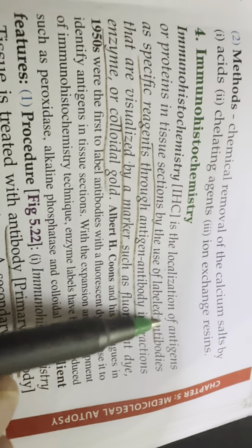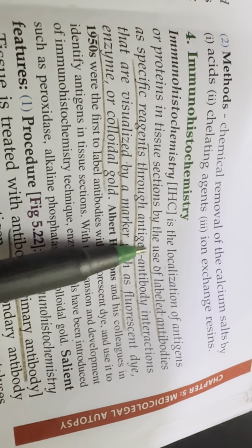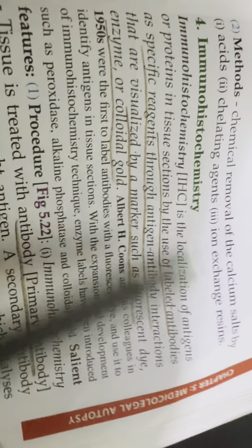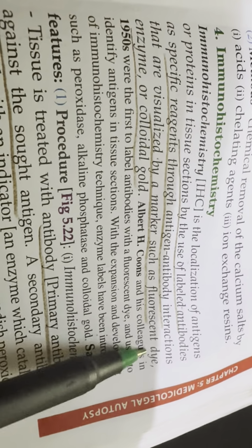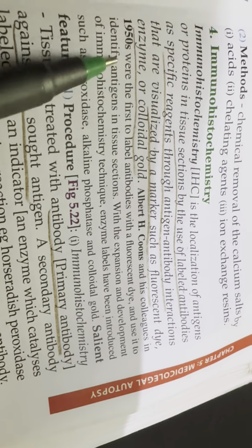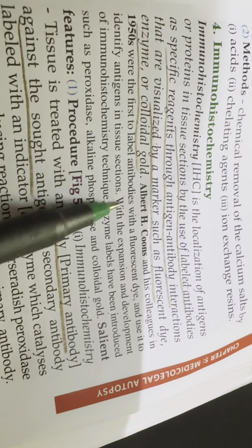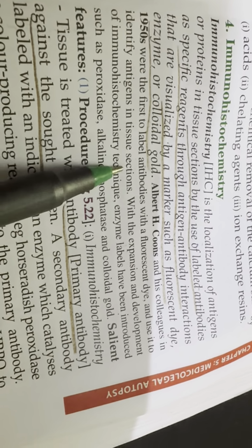Immunohistochemistry is the localization of antigens or proteins in tissue sections by the use of a labeled antibody as a specific reagent through antigen-antibody interaction, which are visualized by a marker such as a fluorescent dye, enzyme, and colloidal gold. Albert H. Coons and his colleagues in 1950 were the first to label antibody with a fluorescent dye and use it to identify antigens in tissue section.